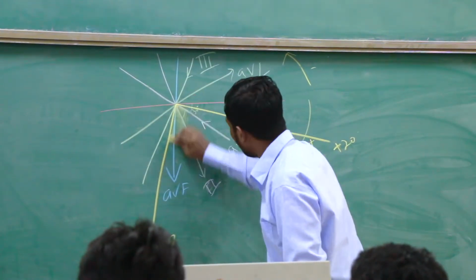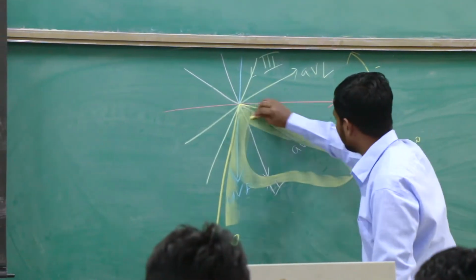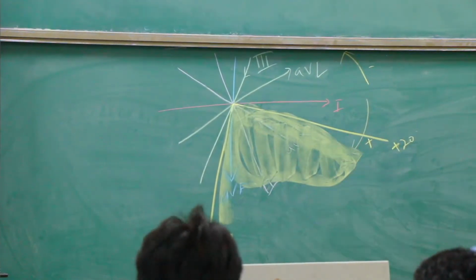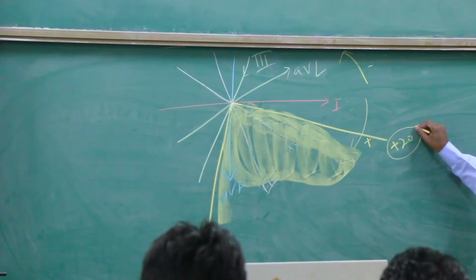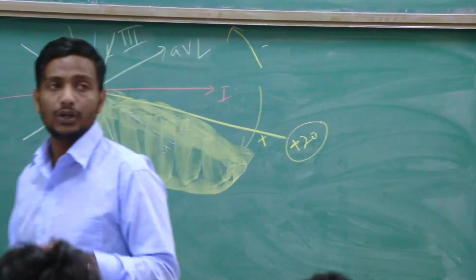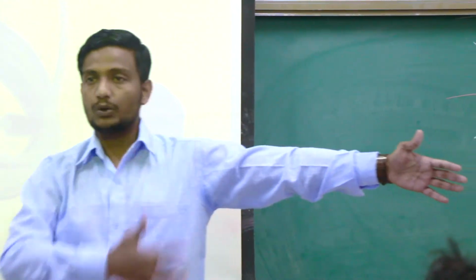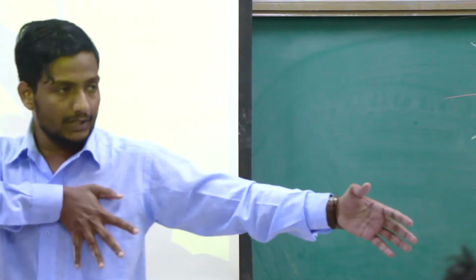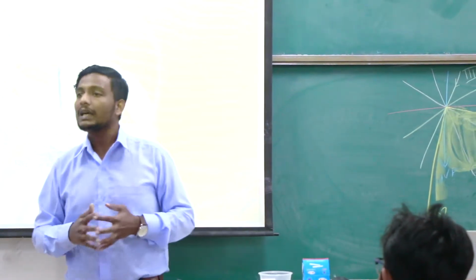So this is the area where your heart lies. This is the area of your heart, like this. Your heart lies between lead 1 and aVF, more specifically from plus 20 degrees to how much? Plus 100 degrees. This is the normal axis of your heart. If I am standing here and all these leads are looking at the frontal view, my heart is like this, from plus 20 to plus 100. This is the normal axis.